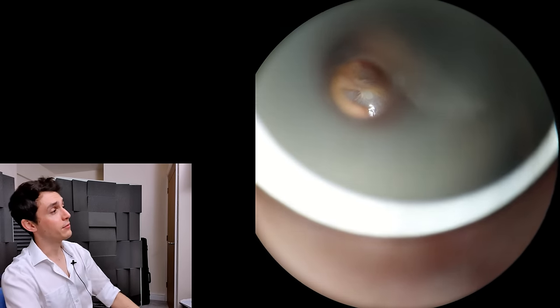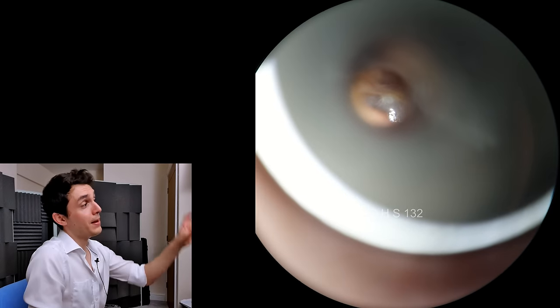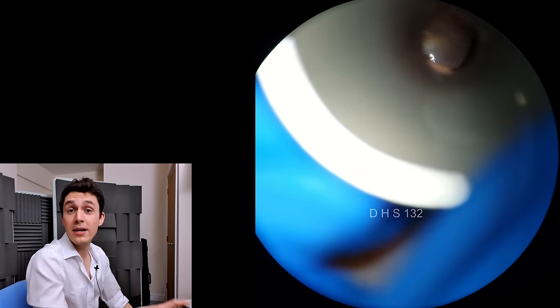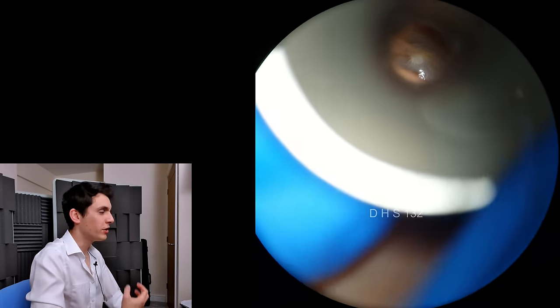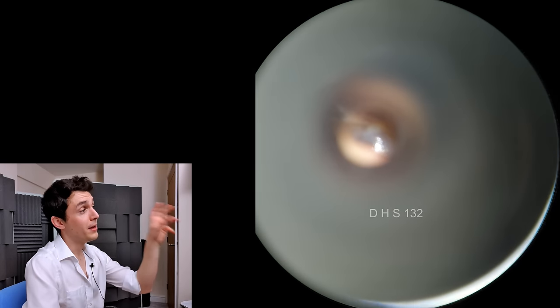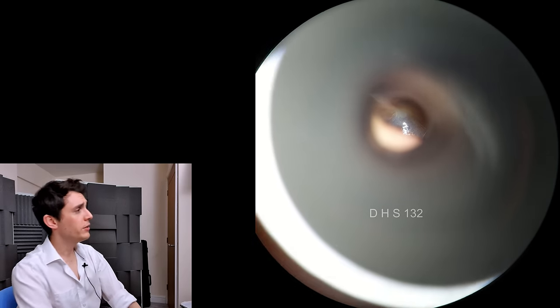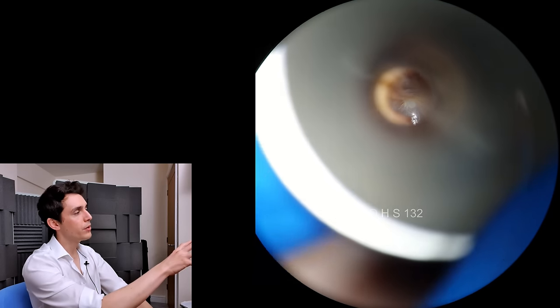We're now going to examine the ear with a speculum. This is a metal speculum that I'm using to look at the eardrum, which I really recommend — I'm not a huge fan of the plastic ones. The metal ones are great and they're sustainable. Lovely looking eardrum there: pale grey, shiny, and we can see the umbo.